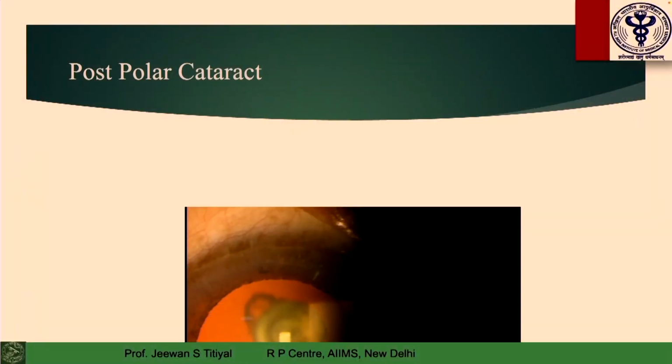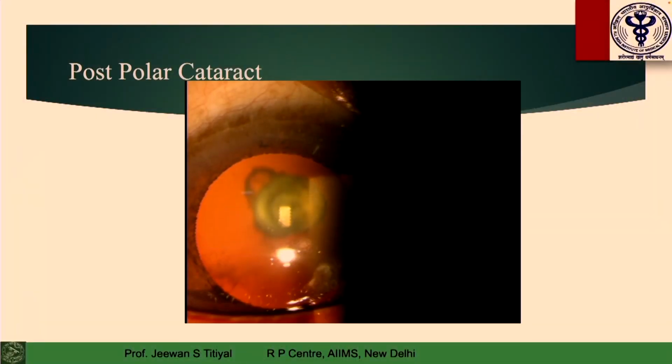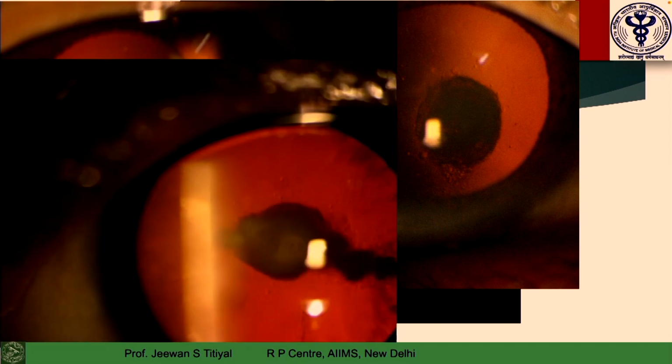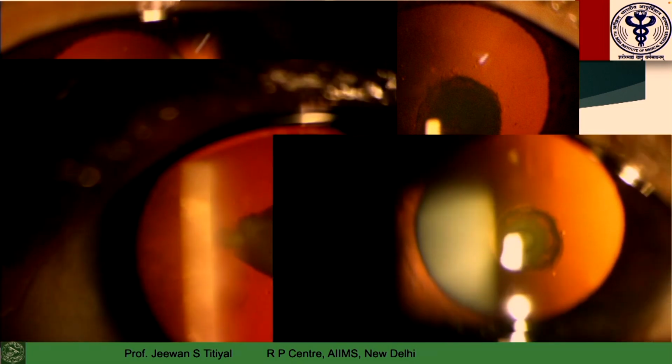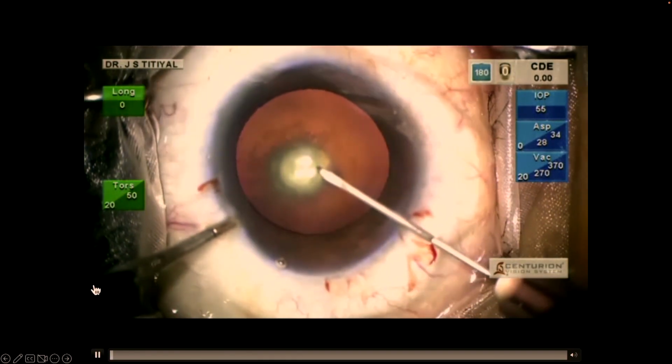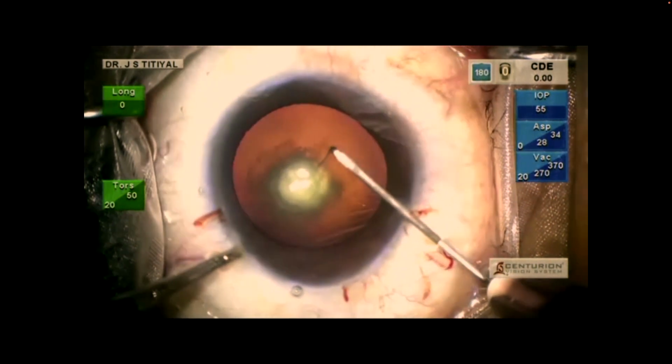So what is this pseudo hole which people have described earlier, which I have renamed as an intraoperative PPCDD? I'll come to that. What is this sign? No financial disclosure from my side. These are various clinical presentations of posterior polar cataracts. They would be in different shapes, sizes, colors, or different types of morphology as far as examination is concerned. They all give you different challenges, and we know how to perform surgery is classically described, and you people have been doing those surgeries also.